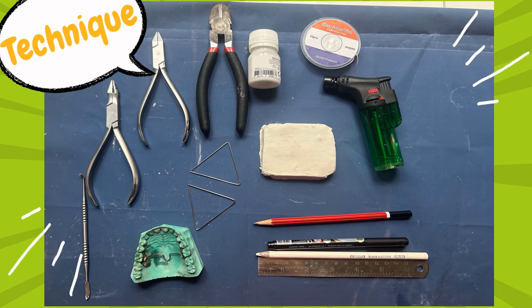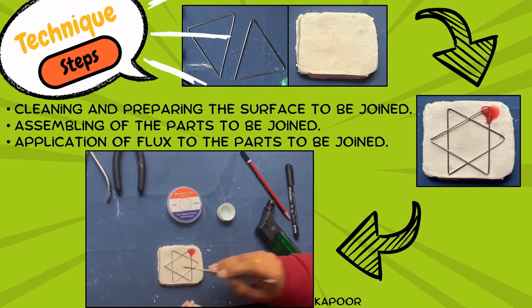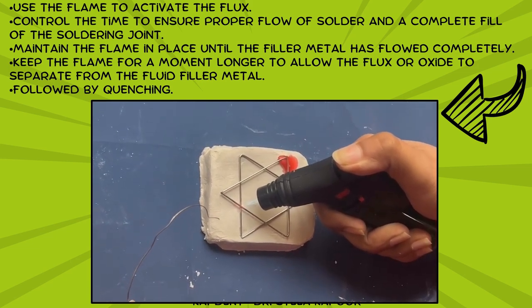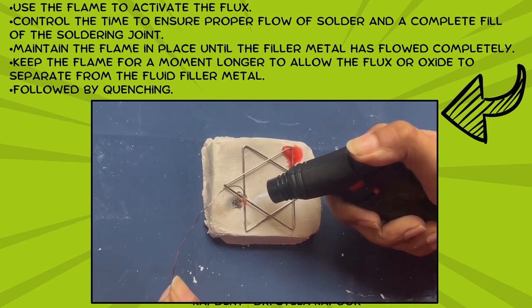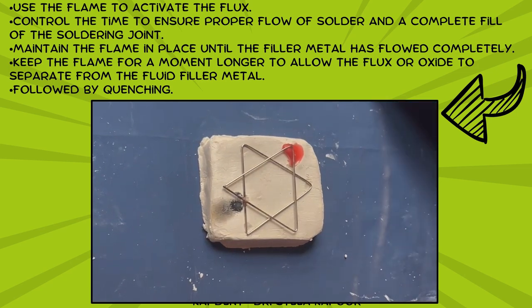Now let's look at the technique of soldering. The armamentarium includes a plaster or stone slab on which the surfaces are stabilized. We begin by cleaning and preparing the surface, assembling the parts, then applying flux to the parts to be joined. We then use the flame to activate the flux, with the objective of getting the joint space red hot before the filler metal is introduced. The flame is maintained until the metal has flowed completely, avoiding oxygen incorporation and oxide layer formation. We keep the flame a moment longer to allow for the flow and separation of flux from the joint space. This is followed by quenching in cold water, which serves two purposes: rapid cooling and removal of strain formed during soldering.